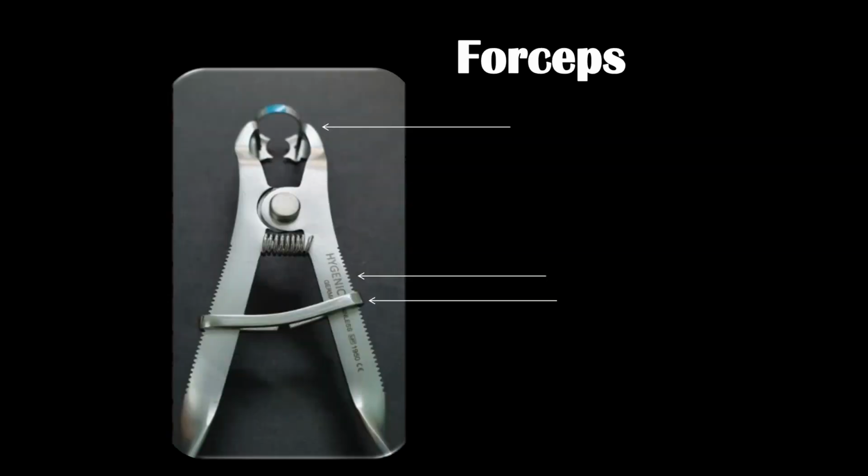Now this is the design for B2 and B3, that is, the jaws are asymmetrical. If you see the deciduous molars, generally the buccal is much wider than the lingual, and hence we require this kind of a clamp. And wingless clamps are a great asset in kids, especially Brinker's, because it puts minimum pressure on the gingiva and the patients are very comfortable during the procedure and they become cooperative.